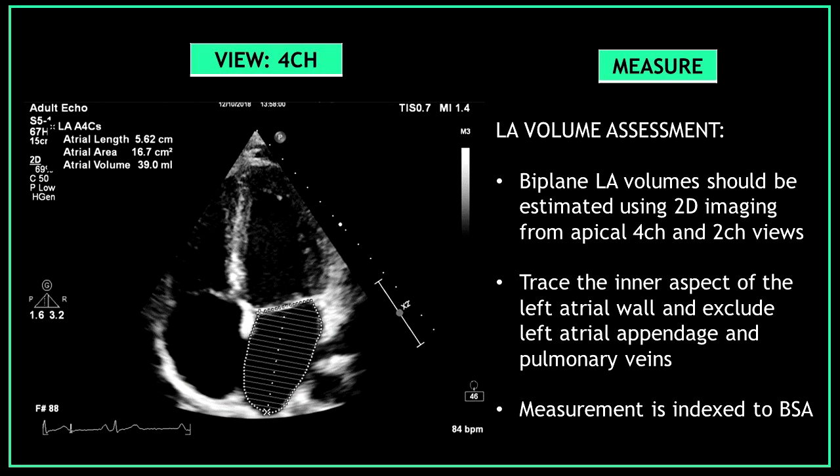Now let's continue to the left atrial volume assessment. Biplane LA volumes should be estimated using 2D imaging from the apical 4 chamber and 2 chamber views. Trace the inner aspect of the left atrial wall and exclude left atrial appendage and pulmonary veins. Also, all measurements should be indexed to body surface area.